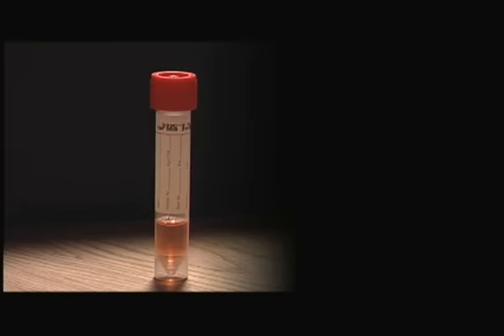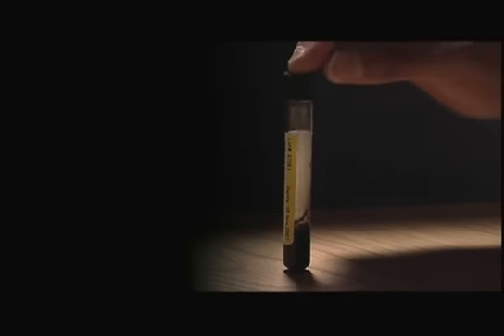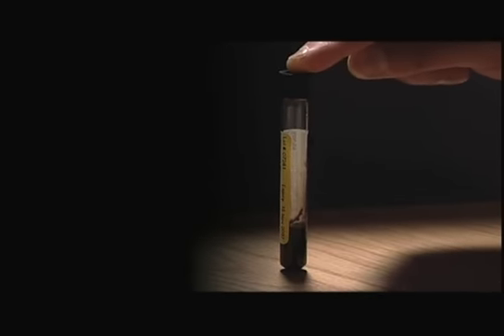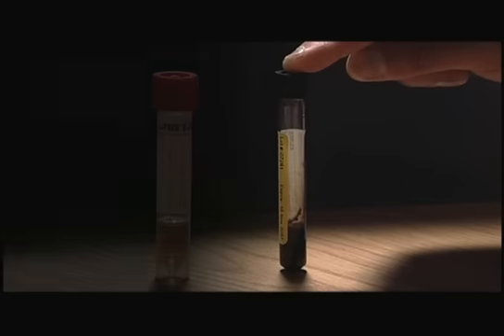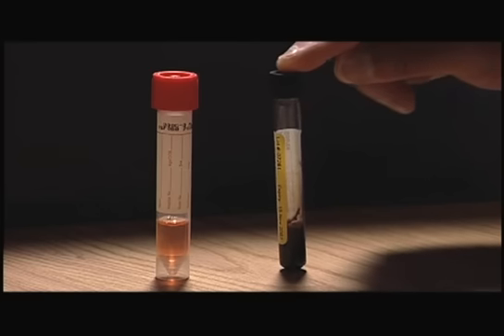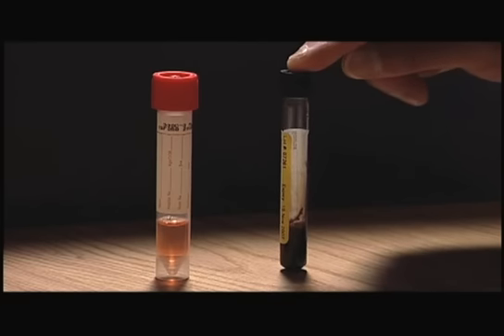Finally, if you're collecting a nasopharyngeal sample for respiratory viruses, send it in this universal transport medium. However, if it is for Bordetella pertussis, send it in the Reagan-Low or equivalent transport medium, which is shown here. Please do not mix the two, as the viability of the bacteria or viruses will be adversely compromised and the sample will then be not accepted.